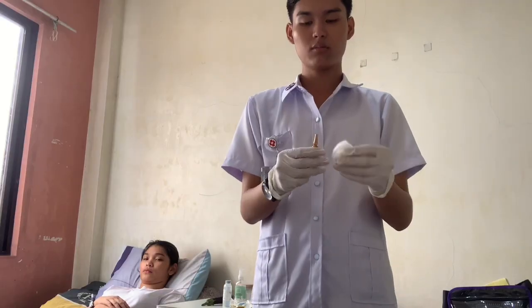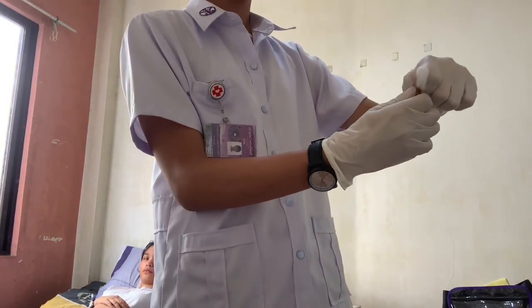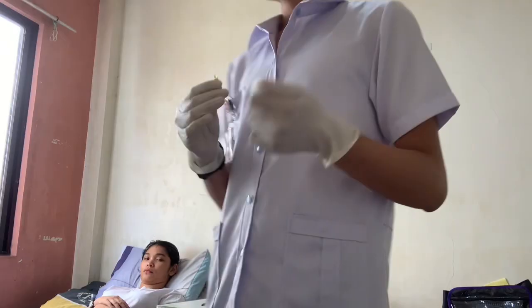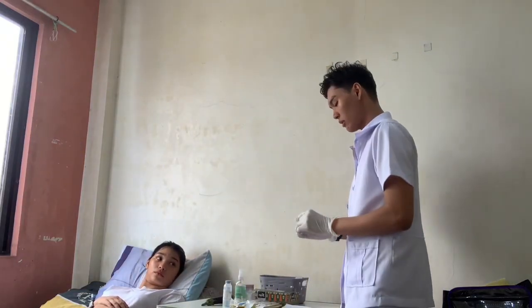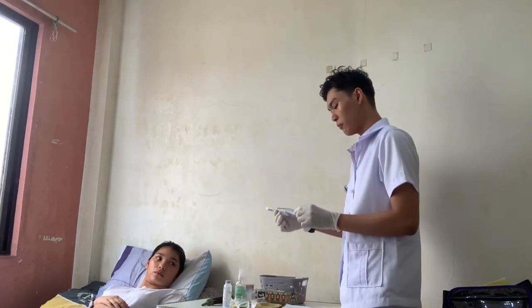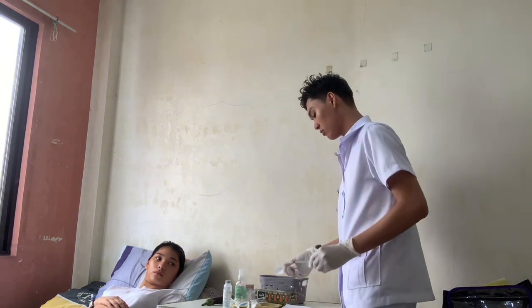So now, since I already broke the ampule, discard the neck of the ampule. And then, put the medication into the syringe.